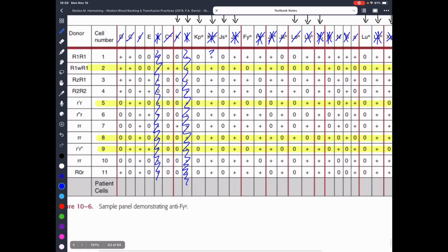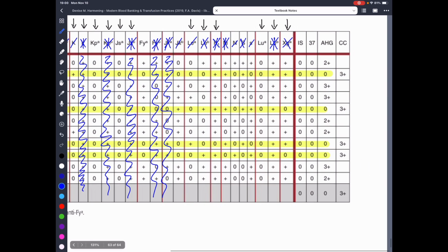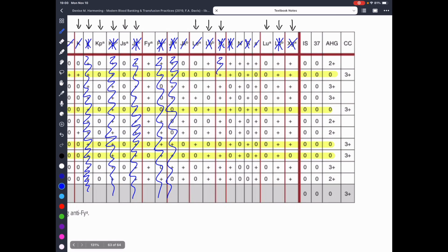KPB, JSB, FYB, JKA, let's see, P1, M, and LUB.